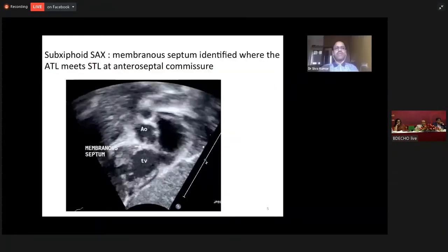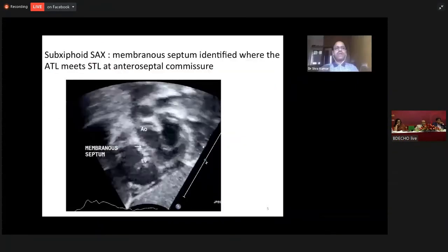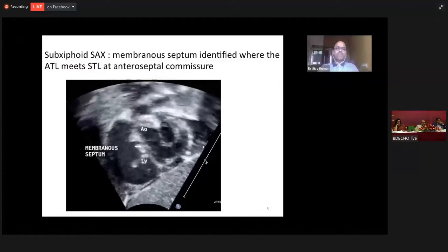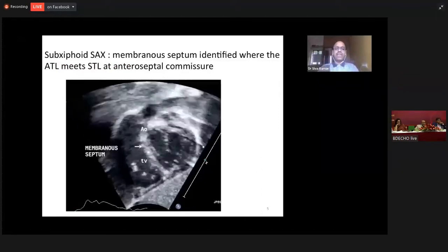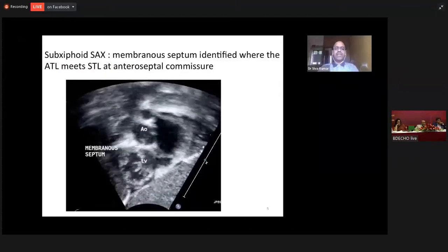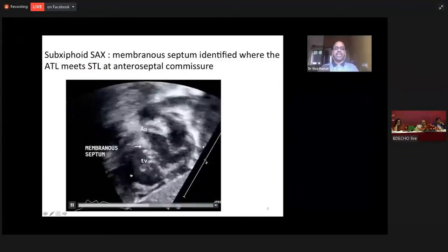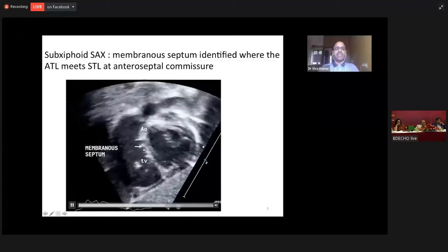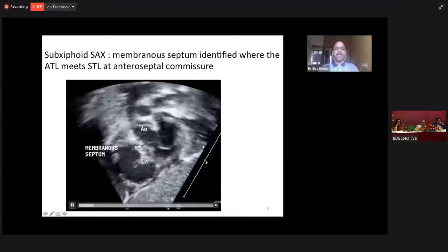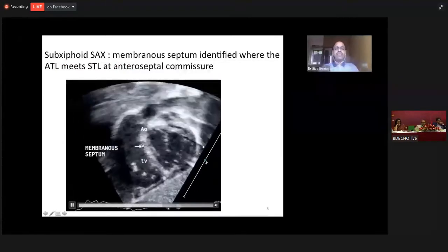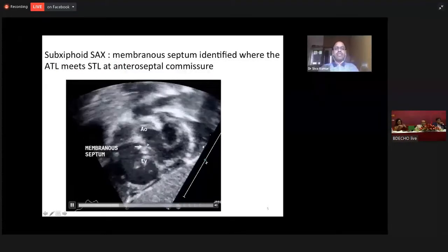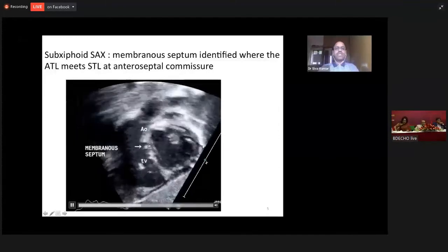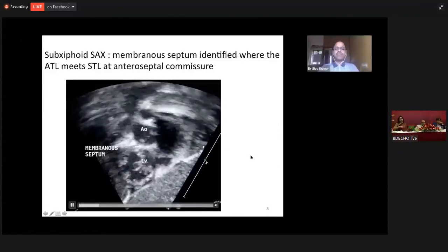In a subcostal view, we have the membranous septum identified where the anterior tricuspid leaflet meets the septal tricuspid leaflet. And it is immediately below the aorta — this portion is the membranous septum.